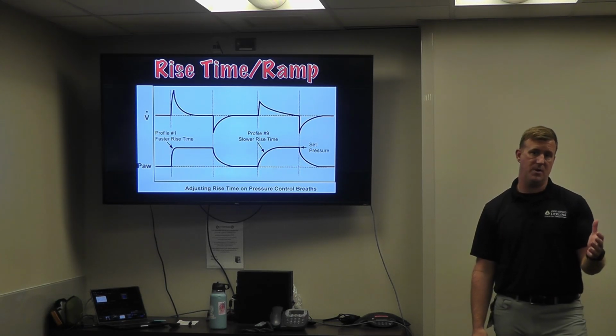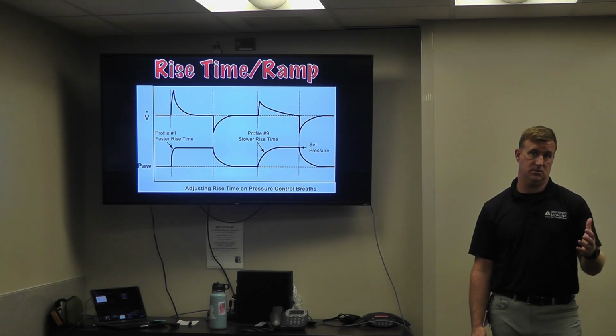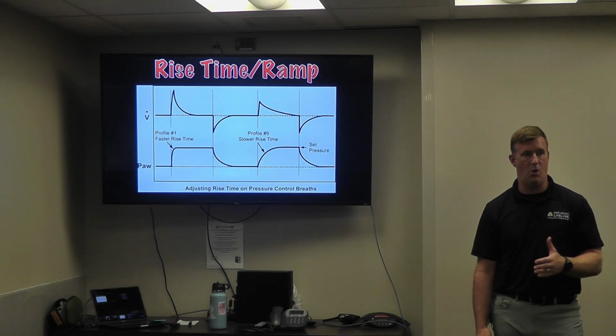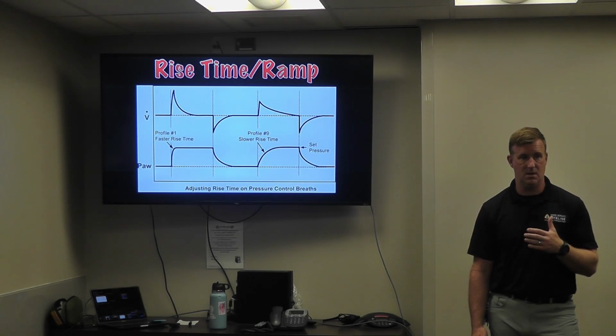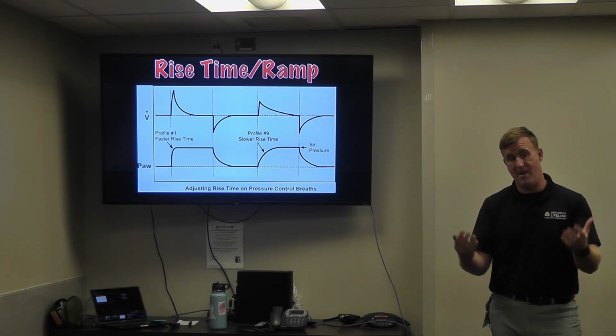I would agree with you, but I will say reflexively and most commonly, these non-invasive patients want their gas as fast as possible. They're air hungry. The other thing to keep in mind is if we took them off a hospital BiPAP machine, this is the reason you always have to change your mask out to your mask most of the time.